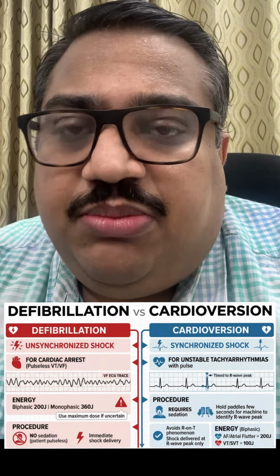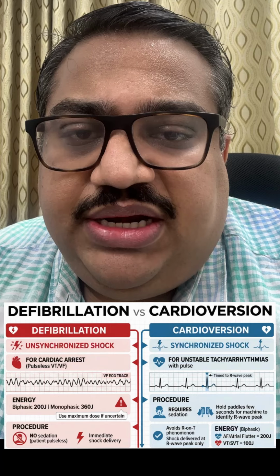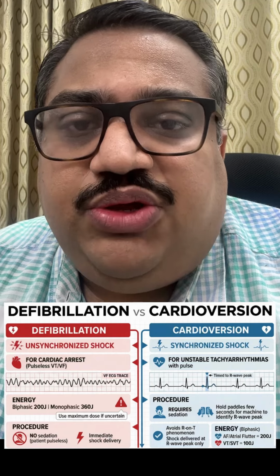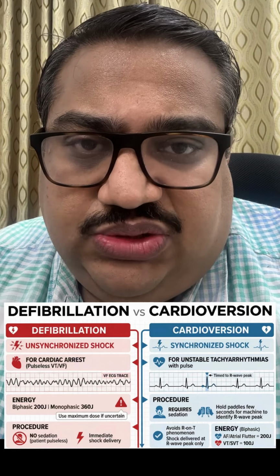So you are not going to synchronize in case of a cardiac arrest, and usually we use a higher amount of energy. 200 joules is the recommendation for a biphasic defibrillator. When you are not sure what energy of shock you need to deliver, you can use the higher amount of energy, whatever is available in the defibrillator. So that is very simple.